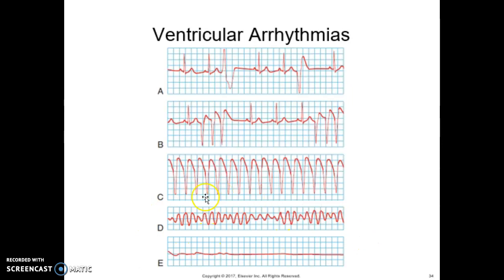So here in figure D, ventricular fibrillation. It's commonly referred to as VFib and is the most critical and life-threatening arrhythmia. It quickly results in death if not treated. So this is a big deal. And then here, what is this one? Figure E is asystole, and it is the result of the absence of a heartbeat or cardiac cessation, which shows a flat line on the ECG, which means we do not have any electrical current, and that is not a good thing.